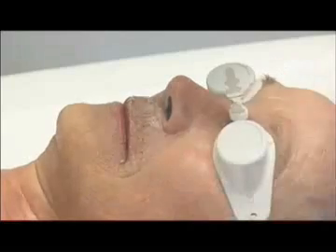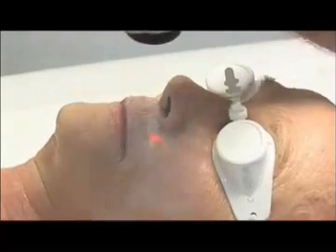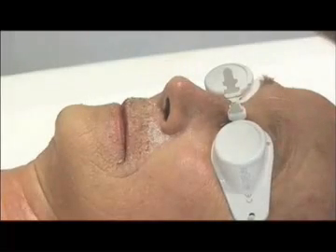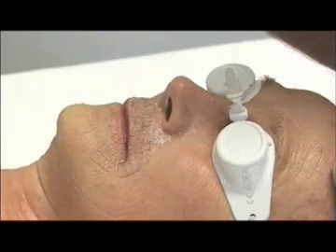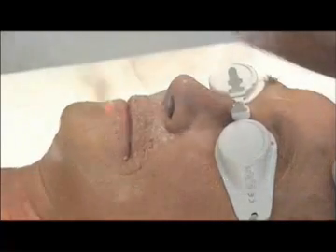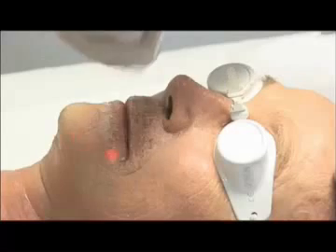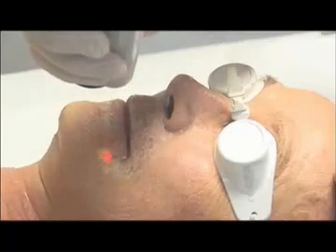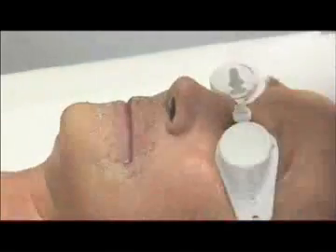As you can see, the anesthetic is only through contact, and it is sufficient to allow the intervention. Voilà, maintenant on continue. On fait le tour progressivement. Voilà, on va souffler un petit peu.